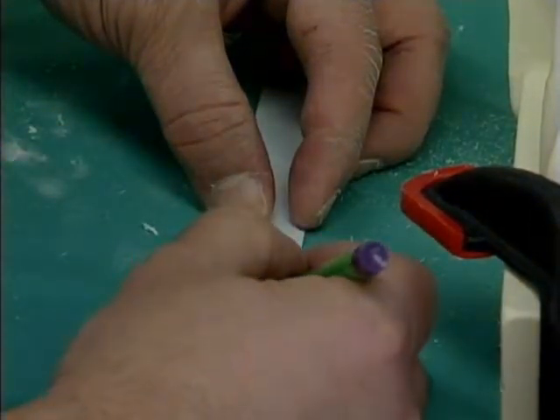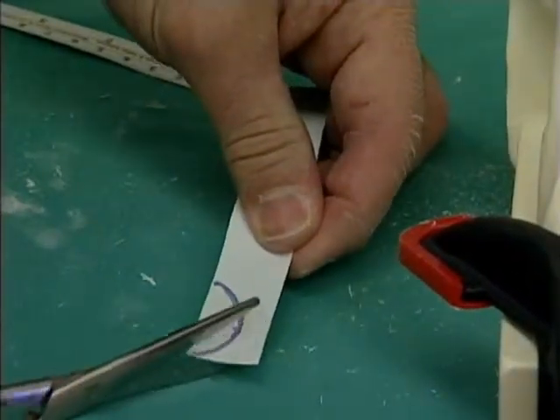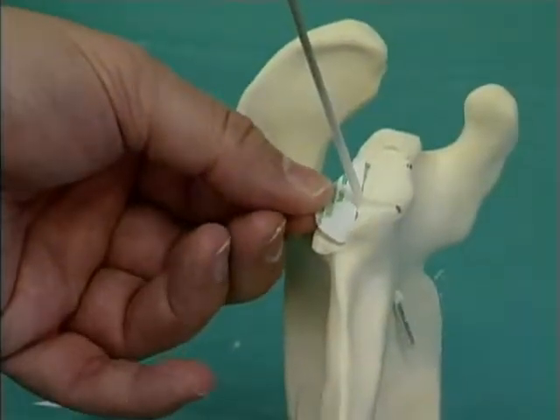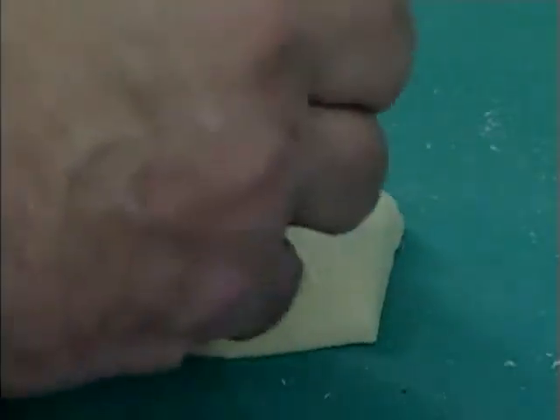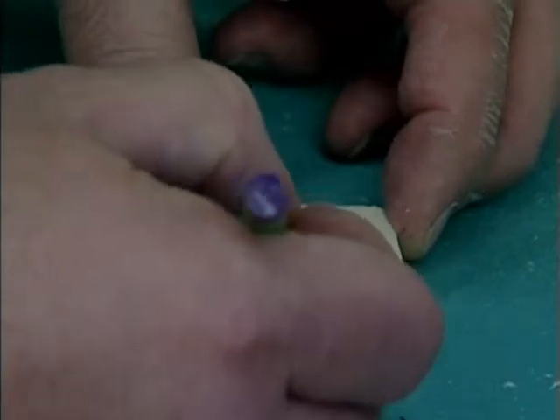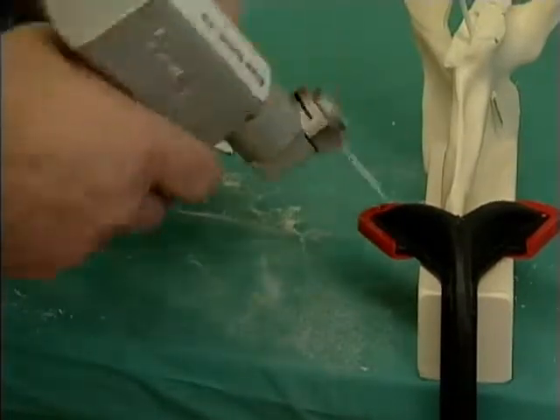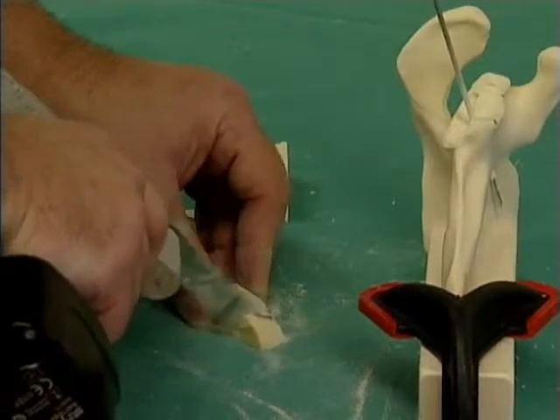This is then used to verify the bone graft shape is correctly sized for the defect. This template is then used on the resected humeral head, which is then traced onto that portion of the head such that it can be shaped with an oscillating saw. The oscillating saw is then used to cut the shape as a bone graft that has approximately 8 millimeters thickness posteriorly and 3 to 4 millimeters anteriorly.